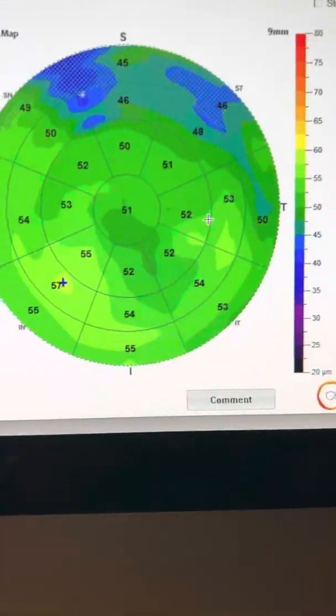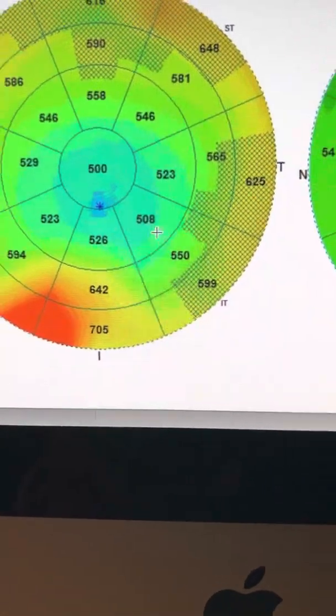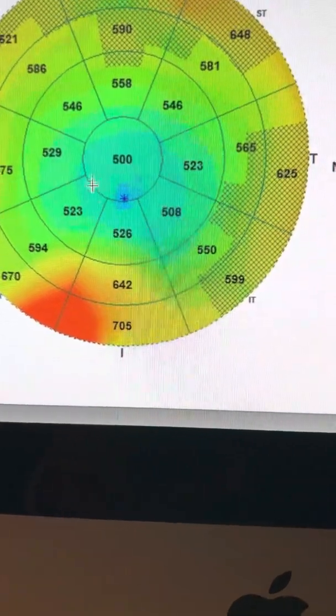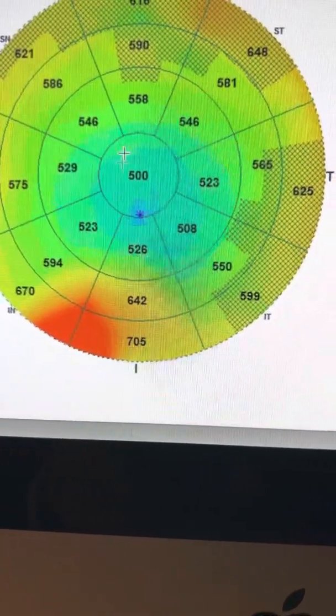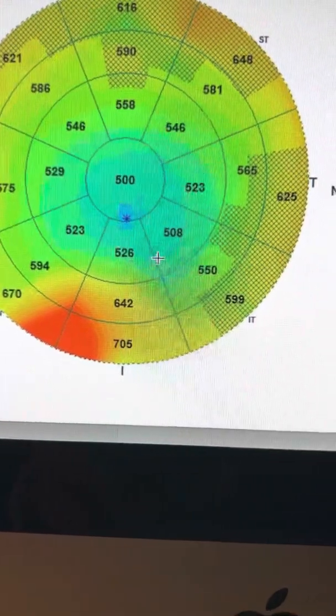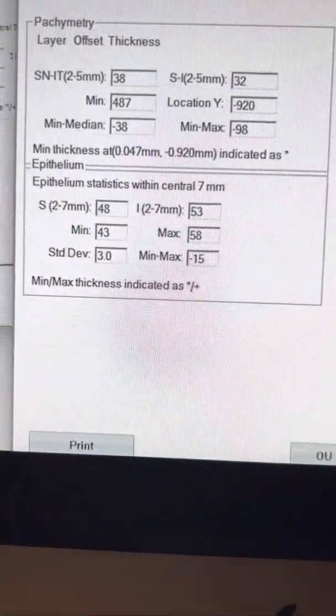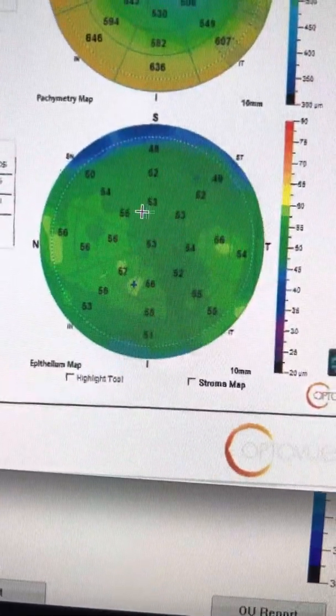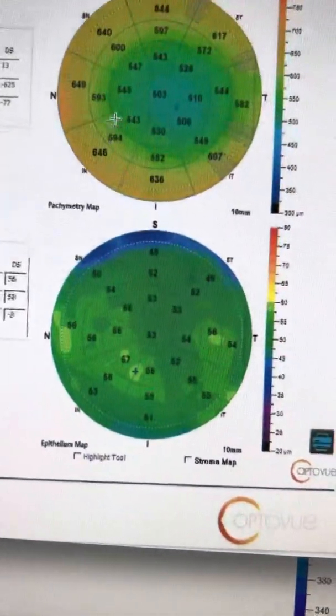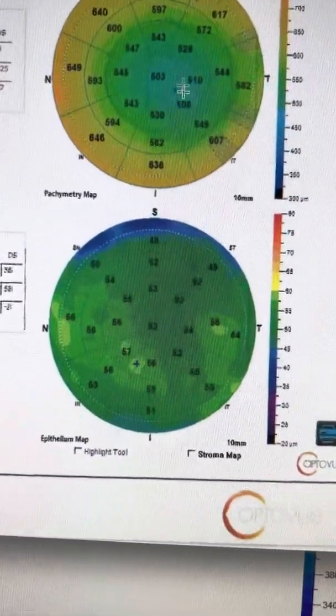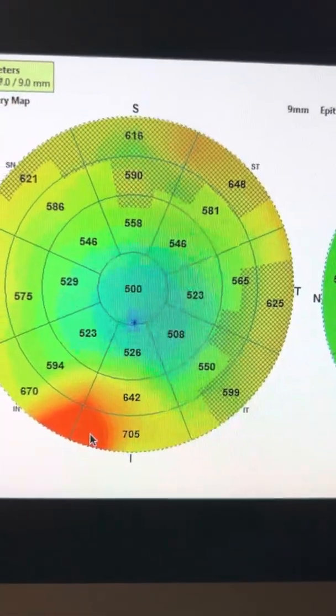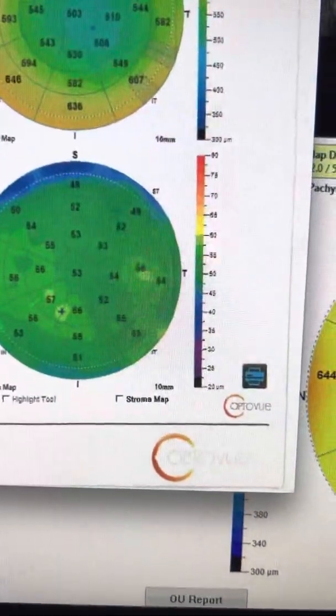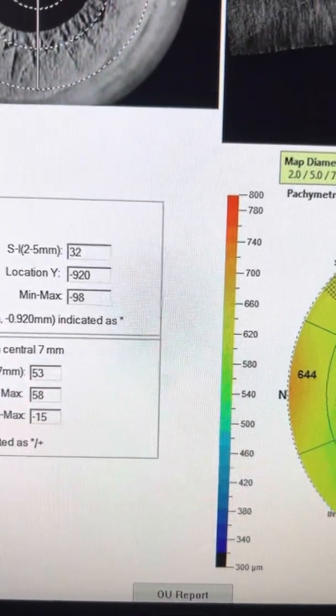By the way, looking at the OCT images of the left today, the left remains naive, although we're starting to see that the difference in central thickness of the cornea is starting to change compared to the ones back in April. So you can see how there's less changes here, and the thickness change in the center is less evident than it is today. Thus, there may be some eye rubbing going on.